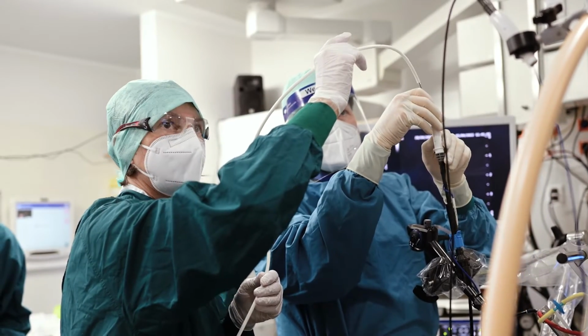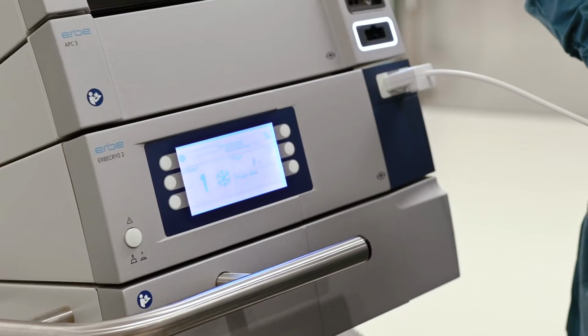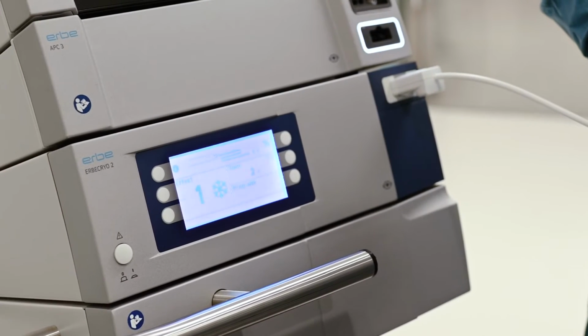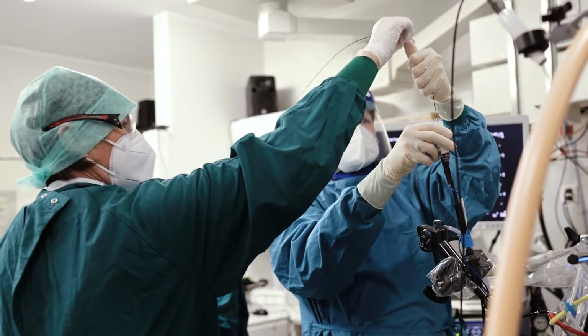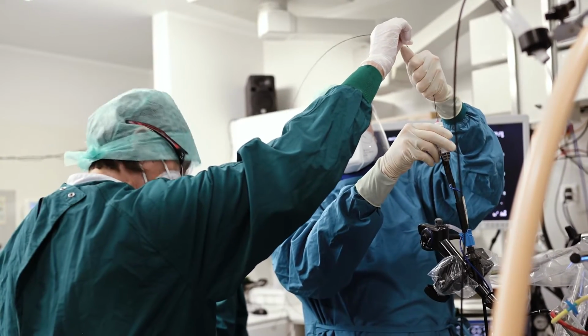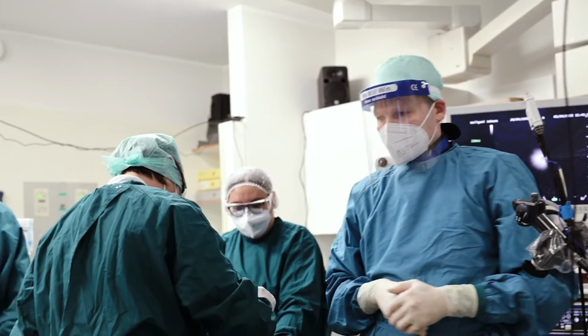Freezing is activated for 3 seconds before the cryoprobe is extracted through the extended working channel. The freezing function remains activated until the sample has left the patient. Premature thawing induced by the patient's body temperature could lead to loss of the sample should activation be interrupted.